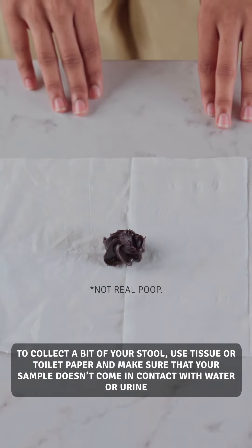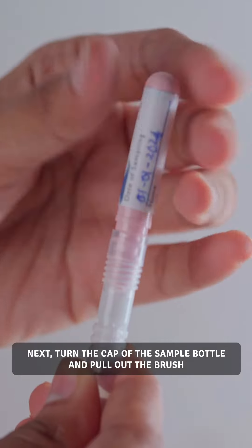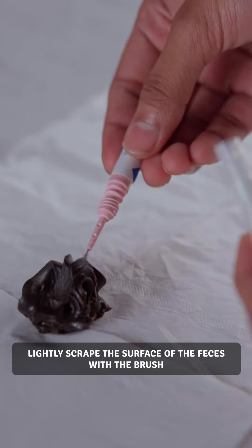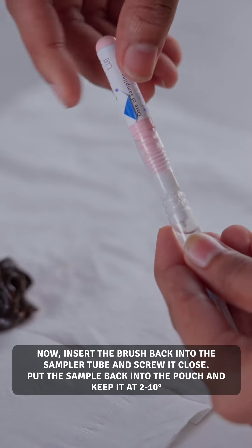To collect a bit of your stool, use tissue or toilet paper and make sure that your sample doesn't come in contact with water or urine. Next, turn the cap of the sample bottle and pull out the brush. Lightly scrape the surface of the feces with the brush. Now, insert the brush back into the sampler tube and screw it closed.